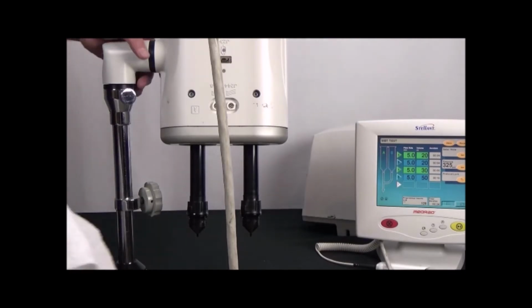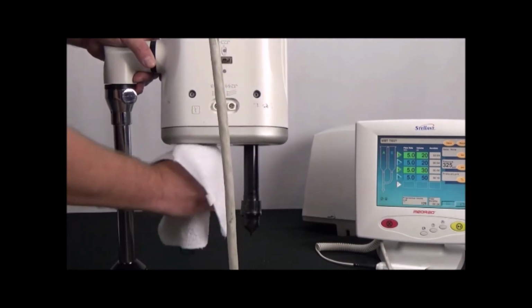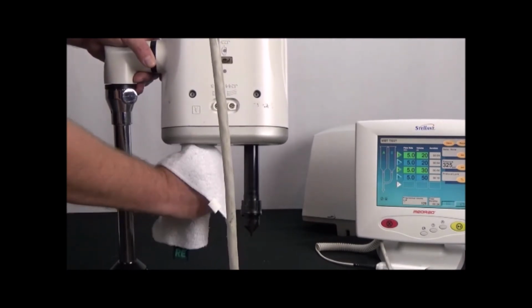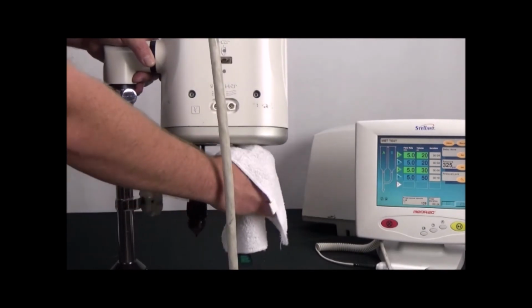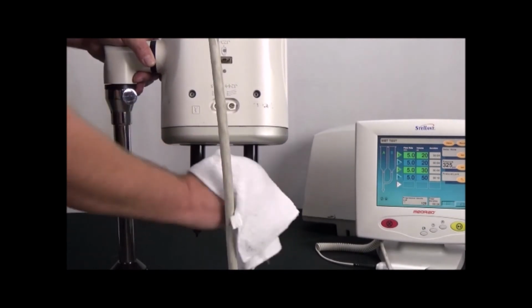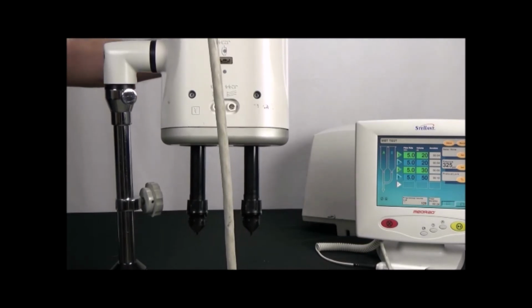With a very damp cloth, clean both pistons of any dried contrast or saline. When doing this, be sure to leave some moisture on the pistons. With beads of moisture still on the pistons, using the reverse buttons on the injector head, completely retract the pistons.